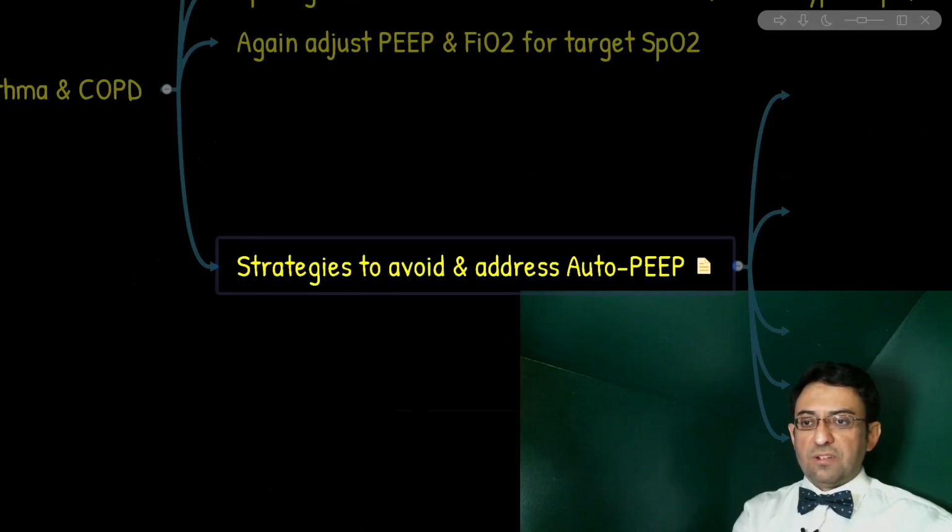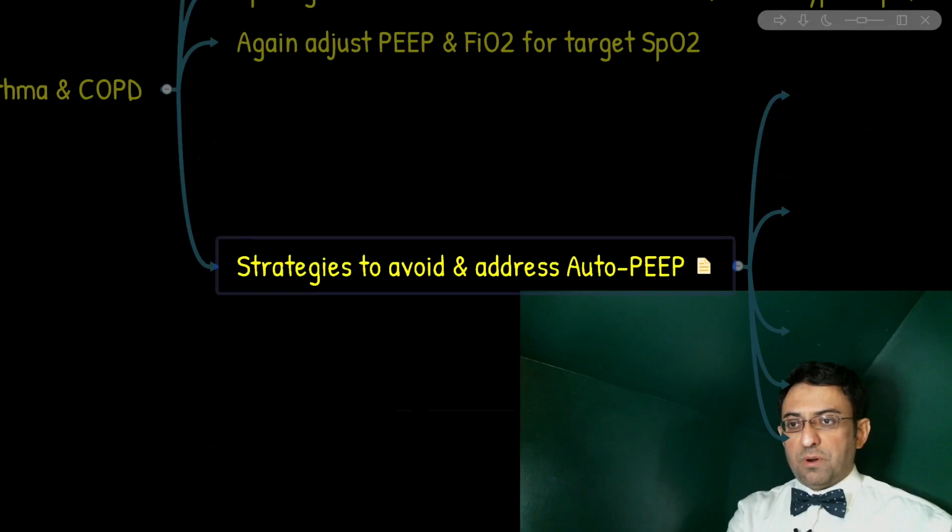Case: you have a patient with history of COPD who has come to the emergency room with altered mental status, and the ABG shows evidence in favor of mixed respiratory failure. You initiate BiPAP non-invasive ventilation, but the patient does not respond during your 90 minutes of monitoring, so you perform elective intubation.